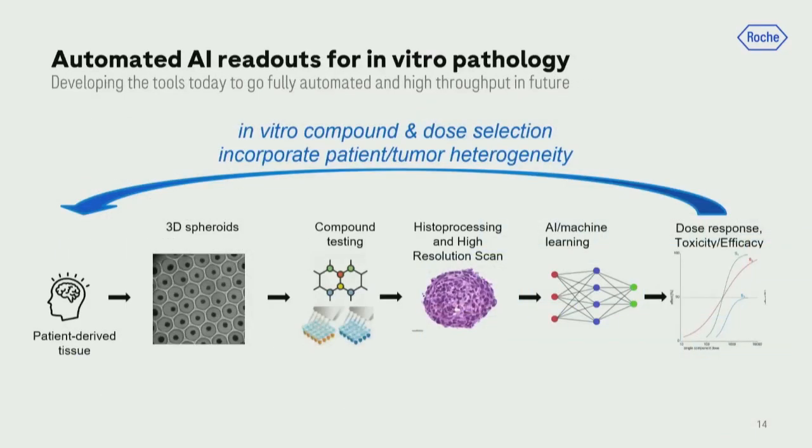So this brings me back to the overview slide. So what we envision is that the toxicologic pathologists could use those standard histology readouts of the complex in vitro models to really identify the important mechanisms of the compounds on those 2D slides. They can quantify its respective impact due to the high resolution, also the high number. And once identified those mechanisms, you can dig deeper, as Julia already mentioned. You can then apply the confocal microscopy, which is more laborious, or lattice light sheet, and so on and so forth. So really, first you identify there's a toxicity going on, and then you can dig deeper.